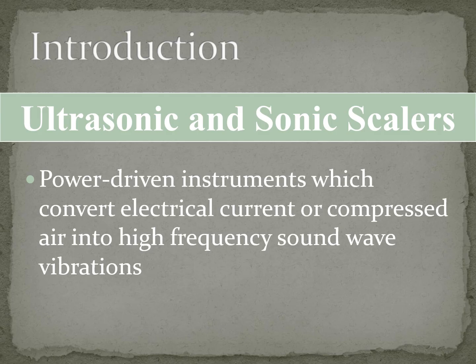Both of them are power-driven instruments, and they work by taking electrical currents or compressed air, depending on if we're talking about an ultrasonic or sonic, and they turn that into a high frequency sound wave. That high frequency sound wave is then going to produce vibrations, and that is what is going to make our instrument work. Now, they're all going to work different ways, and we're going to learn about the tips that are available for them, how they work, and which patients we should use them for.